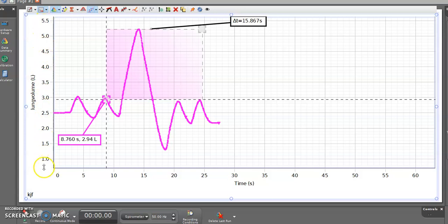So when you're asked to figure out the lung volume or the tidal volume, for example, or the lung capacity, you're going to be using liters. You know the term liters, it's a volume term, and you're going to calculate based on the numbers you see on the side, so you'll have to do some subtraction in order to find the different volumes you're looking for. But let's look at what the arrows actually mean.